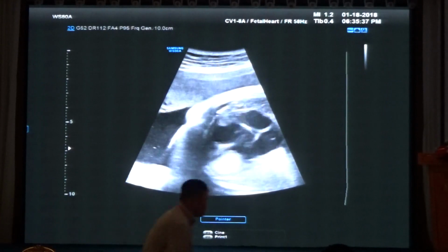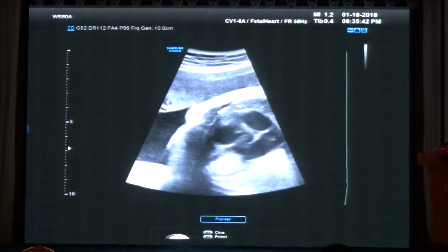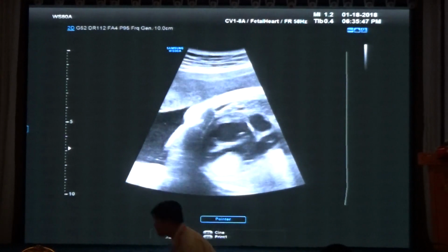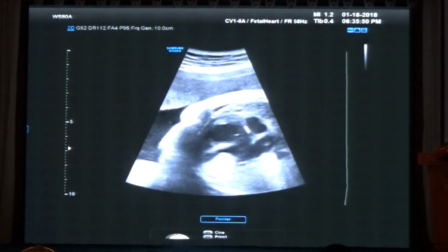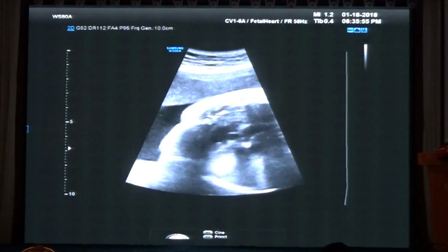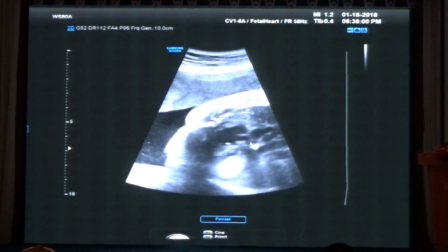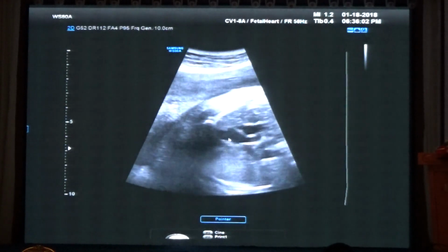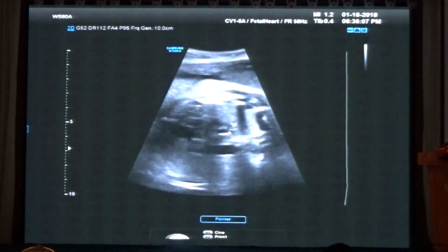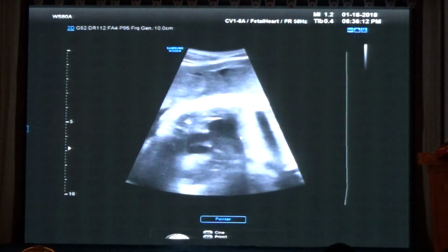So no periventricular nodules. We have to look at the kidneys afterwards to make sure there are no nodules in the renal parenchyma. But this is a good prognosis. So we have the four chamber. We move to the left outflow tract. You see the aortic valve over here. Then we move to the right outflow tract. We have the bifurcation over here, aorta and superior cava, and on the back of the superior cava, you can see the azygos arch. So all this looks normal.